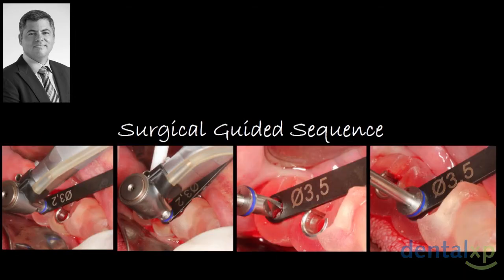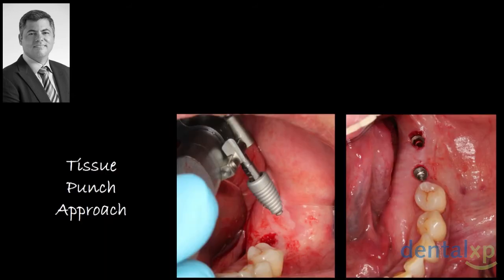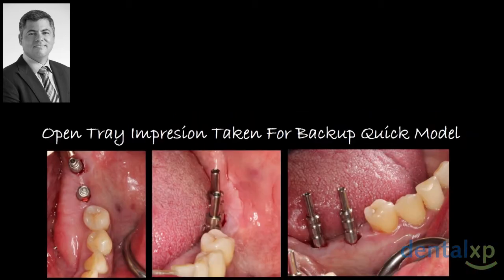It's always good to go slow and to be double checking. We like to do intraoperative x-rays. Do the sequence carefully. Utilize burs that have vertical stops. You can work minimally invasively, or sometimes you have to open flaps and do major reconstructive work, because you have to change the structures of the bone in the operative area, in the surgical area.